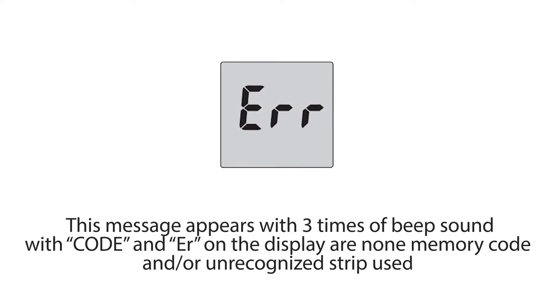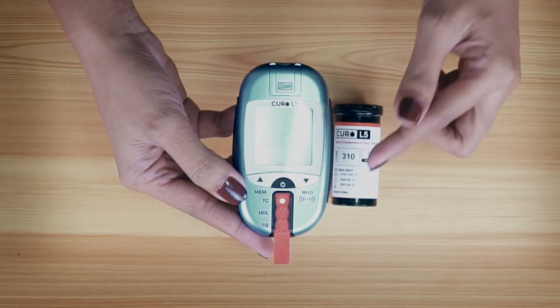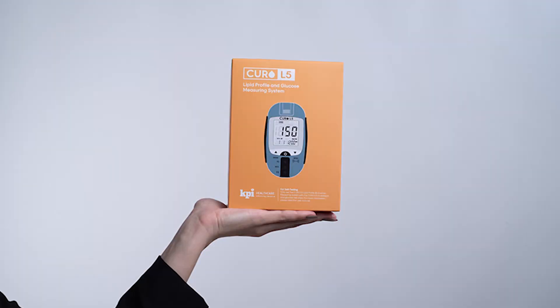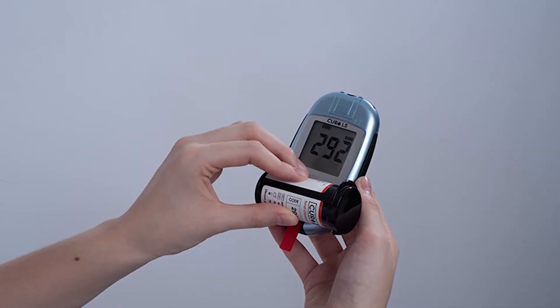Code and ER on the display means non-memory code or unrecognized strip is being used. Each vial of test strips has an RFID tag which enables the meter to recognize its code number automatically. To resolve this, you must code your meter before using it for the first time and each time you open a new bottle of test strips.